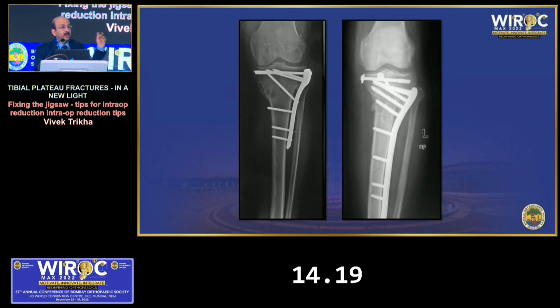So, do not have the second X-ray, have the first X-ray to have your alignment. The tip to it is most of your implants should be parallel to the proximal tibia or the joint line. They will have one central screw which is parallel to it, just as in distal femur, the same way as in proximal tibia. See it on the opposite side. If you put in the plate which is thick in a different way, you might have a varus which will lead to loss of alignment, which will lead to early arthritis, which may not have happened even if you had some amount of articular incongruity. So think about these two things whenever you are treating that.